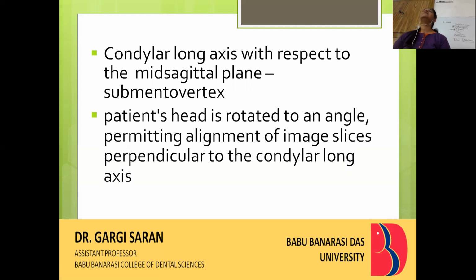We ask the patient to rotate his head to an angle permitting alignment of the image slices perpendicular to the condylar long axis. If we ask the patient to stretch his neck posteriorly and then shoot the radiograph, we always get the condylar heads from the mid-sagittal position.